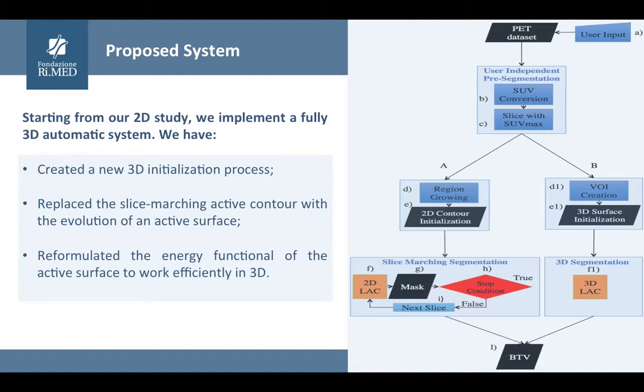method. Starting from the raw segmentation, the major axes of the contour are used to obtain an ellipsoid which contains the tumor. This 3D shape is fed into the next logical block of the system, where the delineation takes place through the full 3D active surface methodology. The ellipsoid is used as input and evolves to minimize the energy E and consequently to fit the tumor silhouette. Also, we reformulated the energy function to work efficiently in the 3D space.